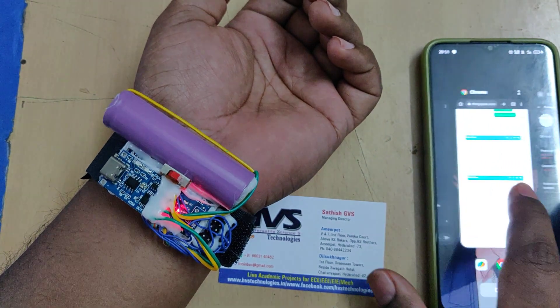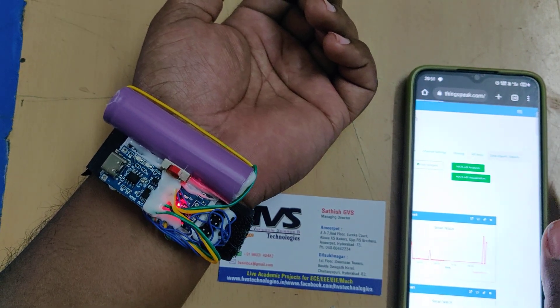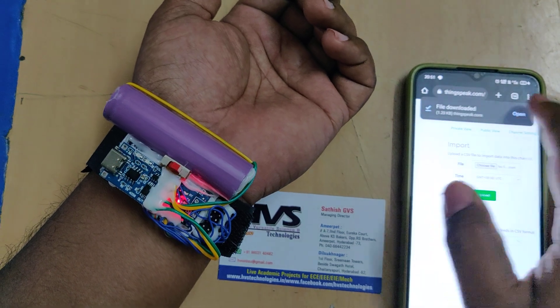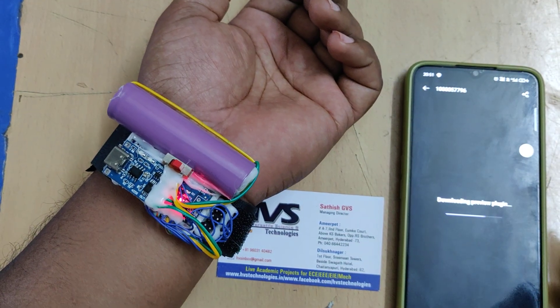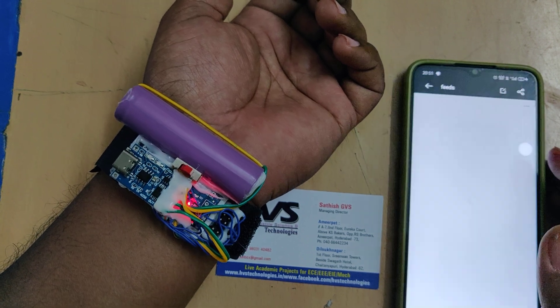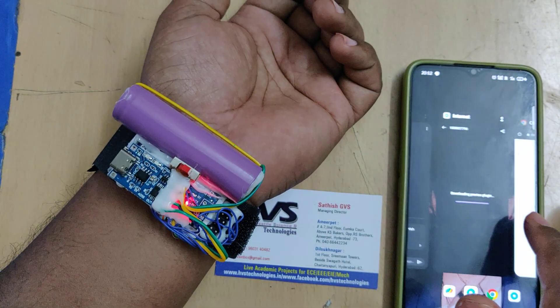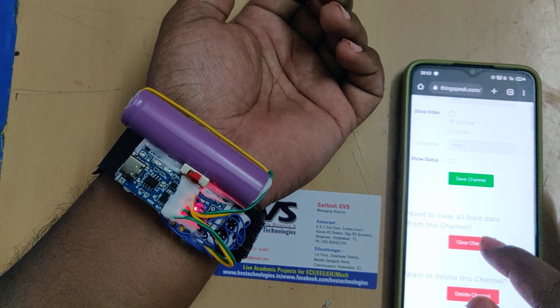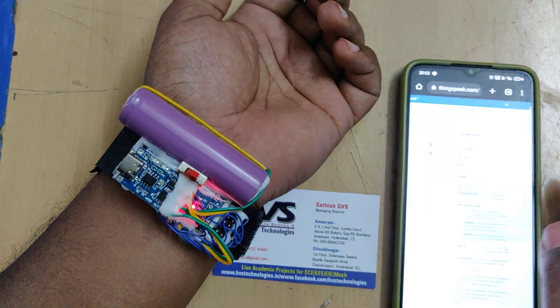Once one device is connected, go to the ThingSpeak cloud platform. Before getting fresh data, erase the existing data — but first download it. Go to Data Import/Export and download the data. You will get it in Excel sheet format containing date, time, number of samples, field one for heart rate, and field two for SPO2 data. After downloading, go to Channel Settings and select 'Clear Channel' — don't delete or make any other changes. The data will then be cleared.